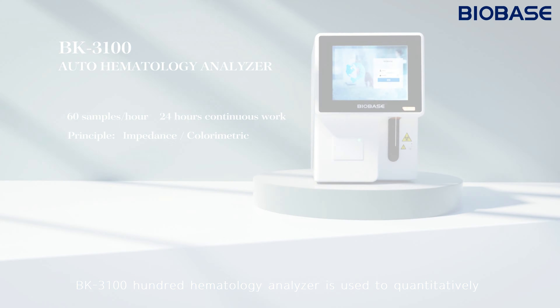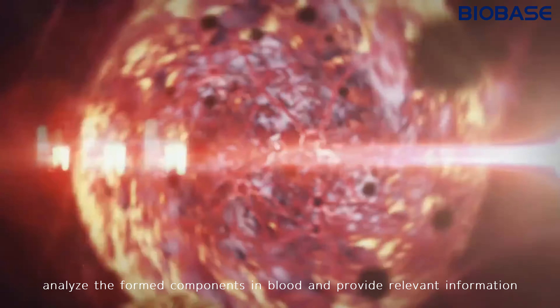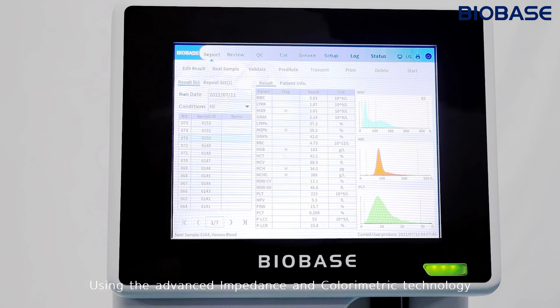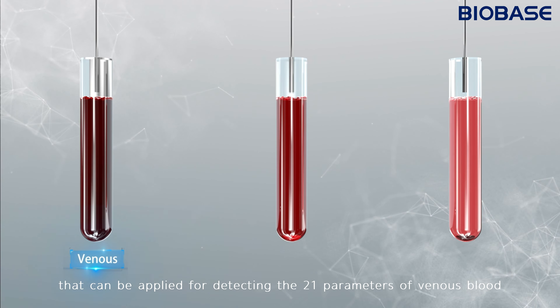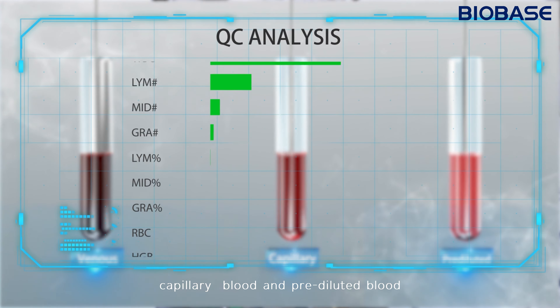The BK3100 Hematology Analyzer is used to quantitatively analyze the form components in blood and provide relevant information. Using advanced impedance and colorimetric technology, it can detect 21 parameters of venous blood, capillary blood, and pre-diluted blood.